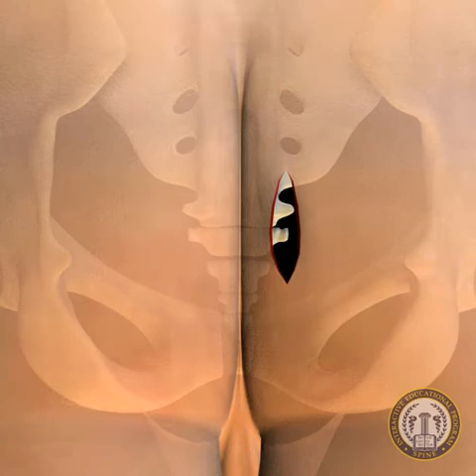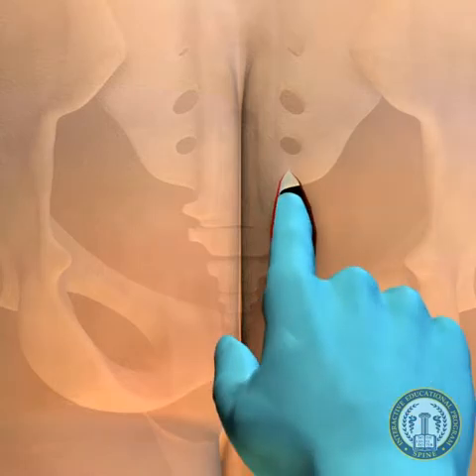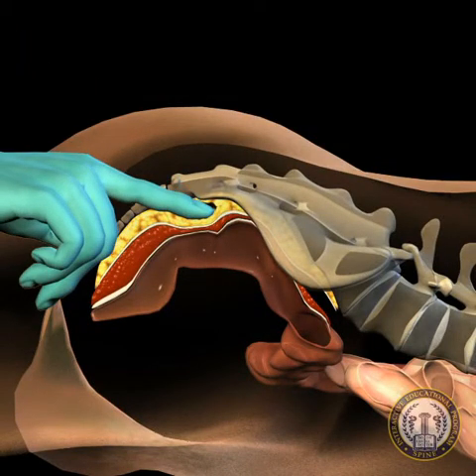Once the parietal fascia is penetrated, the hole should be enlarged to accept the index finger of the surgeon. The surgeon should continue dissecting with the index finger to create a pathway to the sacrum while gently pushing the rectum anteriorly from the areolar soft tissue plane.